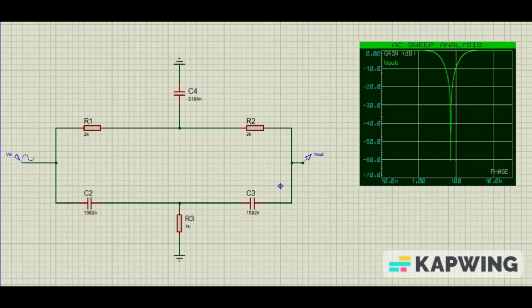In this case, the center frequency that needs to be removed is 1 over 4 pi resistance times capacitance. Here, the center frequency means the specific frequency, the 50 Hz, that needs to be removed. As we can see from the AC sweep analysis for this specific step, there is no gain in the graph, but there is a center frequency removal, which is 50 Hz, from all the amplified frequencies.